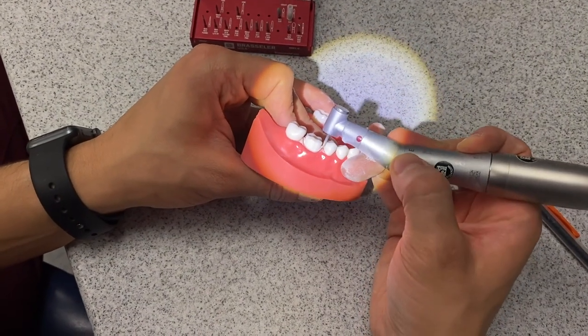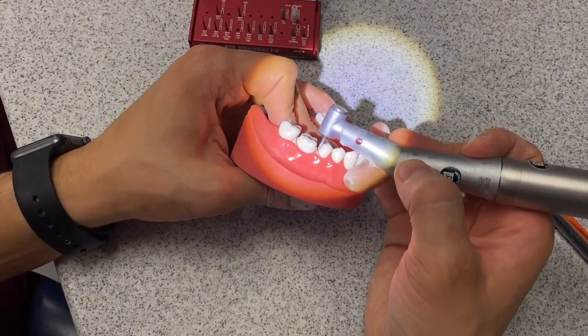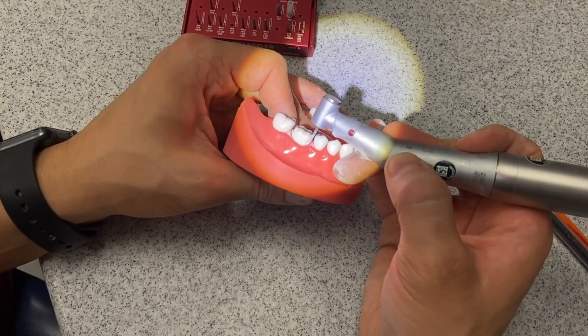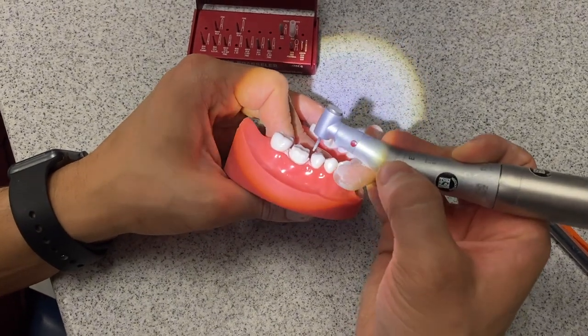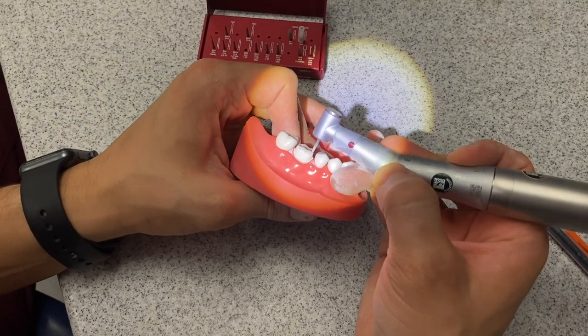This next portion will be the interproximal finish line. It's a little tricky because you can easily nick the adjacent tooth. You want to really measure to see whether the 1 DT is going to be enough to pass. If not, there's nothing wrong with getting the half DT and using that one. For now I'm going to try to keep using the 1 DT and we'll go from there.